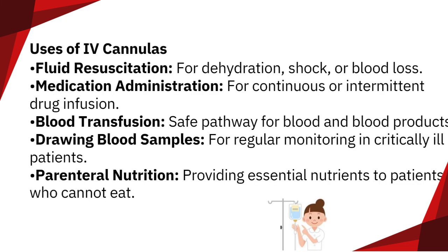Uses of IV cannulas. Fluid resuscitation, for dehydration, shock, or blood loss. Medication administration, for continuous or intermittent drug infusion. Blood transfusion, a safe pathway for blood and blood products. Drawing blood samples, for regular monitoring in critically ill patients. Parenteral nutrition, providing essential nutrients to patients who cannot eat.